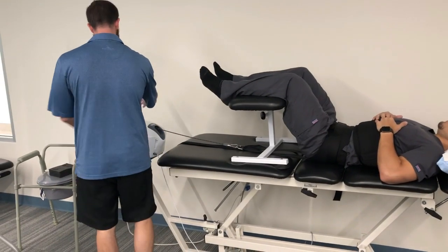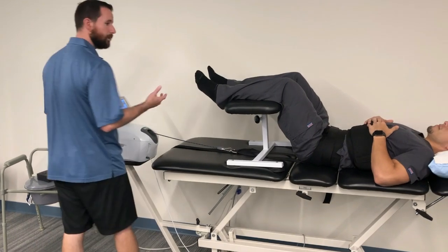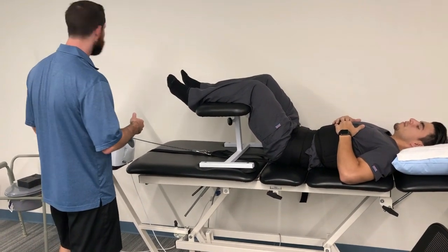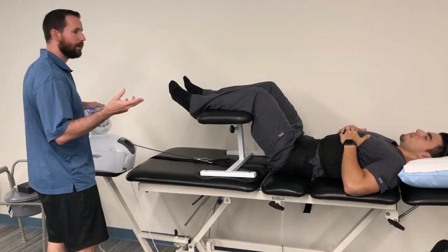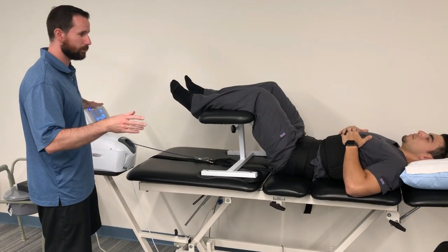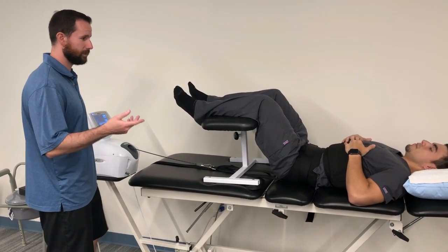So for the settings, I'm going to set it on intermittent. So it's going to be a 1-to-1 ratio of 10 seconds on, 10 seconds off. And then we're going to start off with 5 minutes. I'm going to check in on you, make sure everything's going okay. And then if everything's okay, we're going to do it for another 10 minutes.